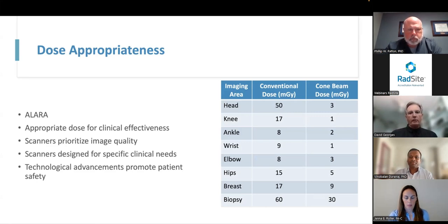So in our particular world, because we are a ConeBeam breast CT, the way that we manage that is we perform an 8 millisecond scout, very similar to conventional whole body CT. That helps us identify, in our case, the appropriate mA selection, because kVp and time is fixed. And so what we have is the opportunity to understand all of the parameters of that body habitus, whether it's adipose, glandular, tissue combinations, or even size and areas of penetration.